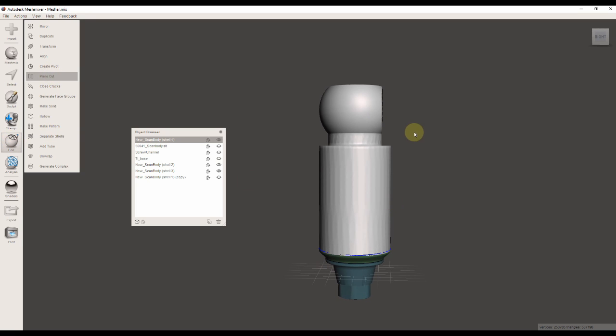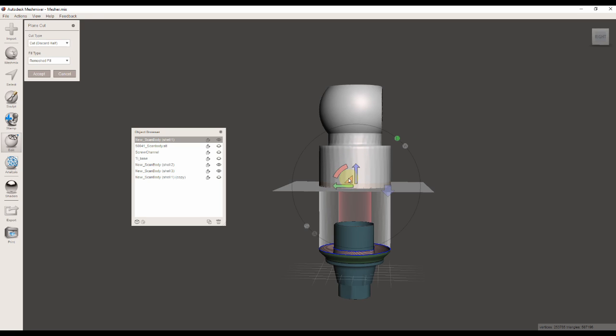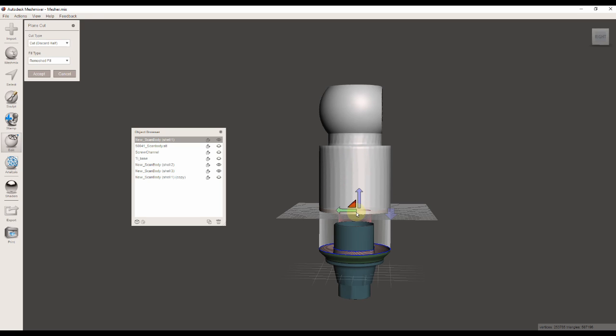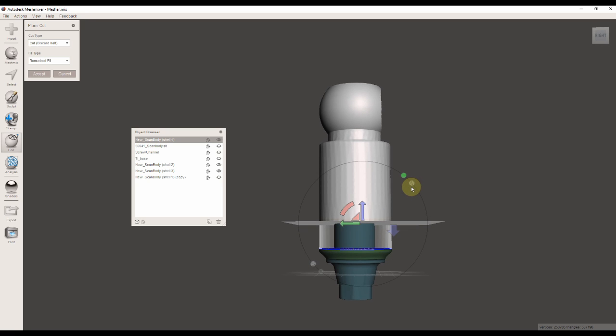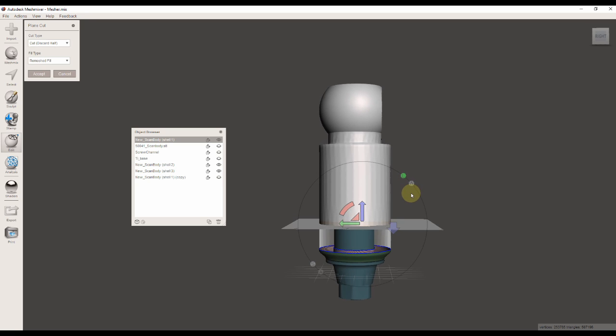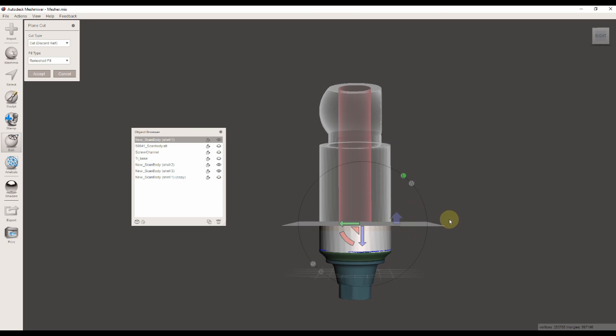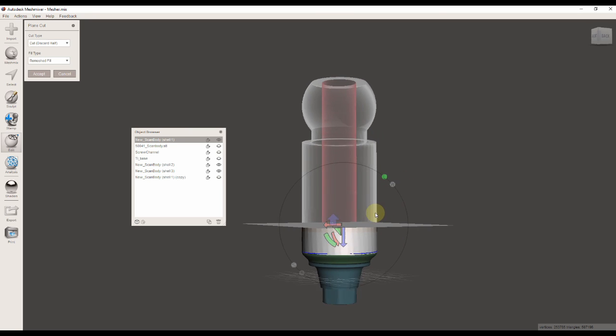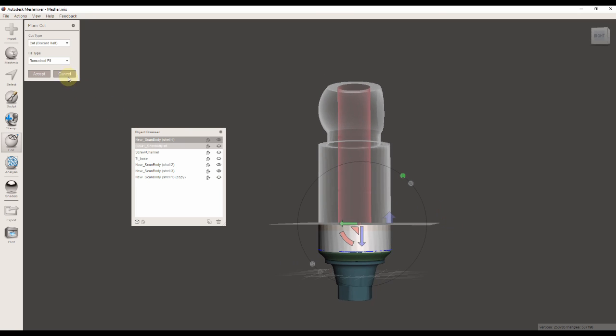When I create the perpendicular plane here, I'm going to make sure I'm not cutting into the head of the actual tie base because that will create kind of an intersection.